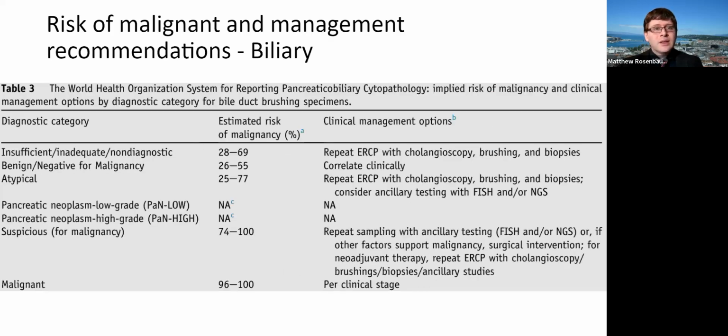This also has a similar thing for biliary. So this is also used for biliary brushings. Someone has a malignant appearing or abnormal looking stricture, they'll get a brushing. My issue with this, of course, we don't have the pancreatic neoplasm low or high grade designations here. This one is a little bit trickier. As you can see here, the estimated risk of malignancy is relatively high in all the populations. So I think this is one of those where oftentimes you really just do have to fit what you're seeing with the clinical picture.